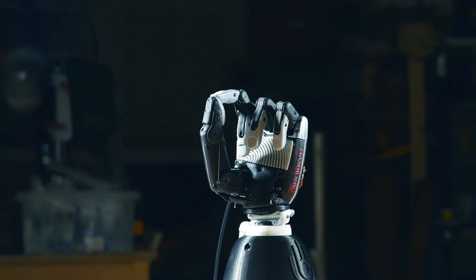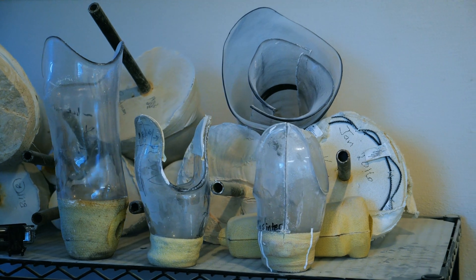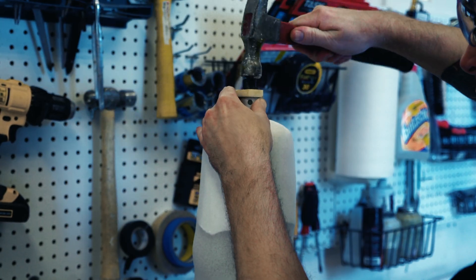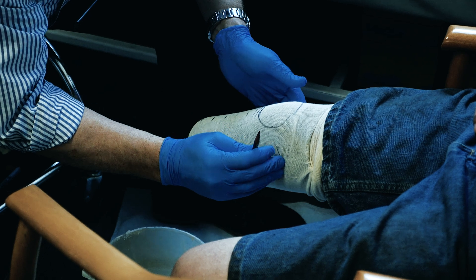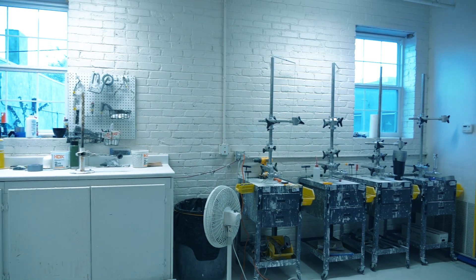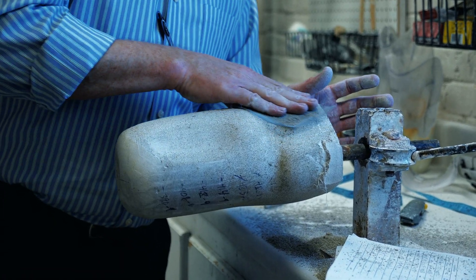Despite billions of dollars being poured into R&D for advanced bionics and smart joints, prosthetic socket manufacturing has undergone little advancement. Building a lower extremity socket is a labor-intensive process requiring highly skilled practitioners, technicians, complex labs, and the use of toxic materials. This process has not seen a transformative upgrade in over 50 years.